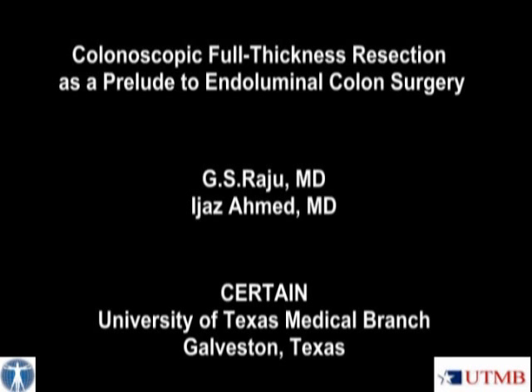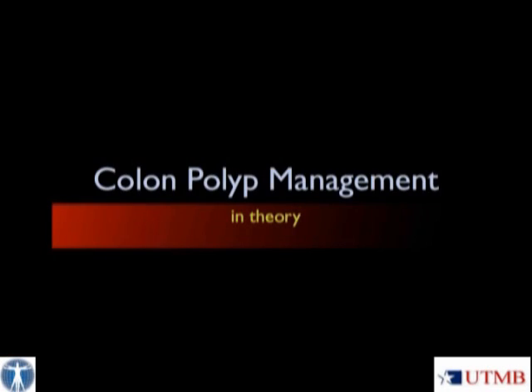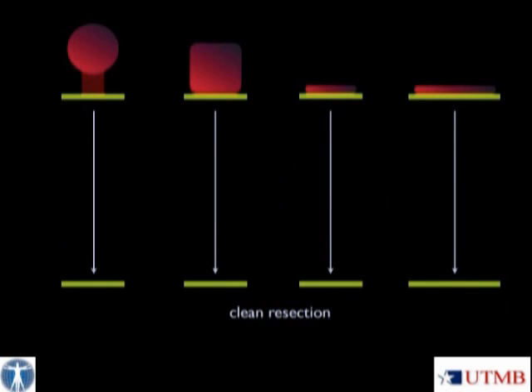Colonoscopic full-thickness resection as a prelude to endoluminal colon surgery. Complete resection of colon polyps is critical to avoid recurrence of colon polyps. The technique of endoscopic resection depends on the type of the lesion.